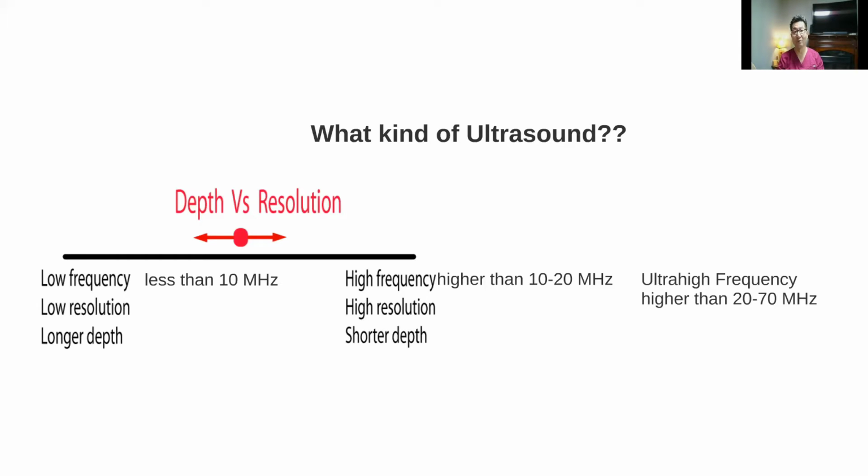If you're going to be searching for advanced lymphedema, it sometimes needs very, very high frequency, but then the penetration could be about 1 or 2 centimeters max, and sometimes you will not be able to locate the deeper lymphatics.